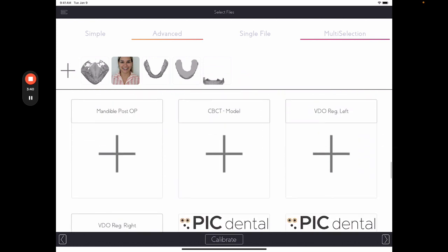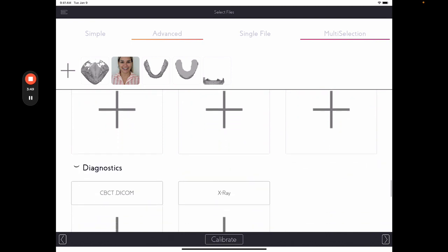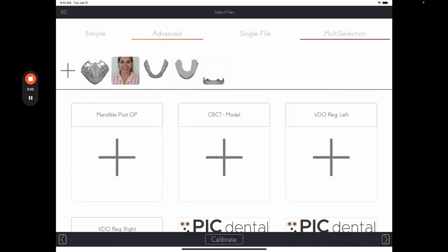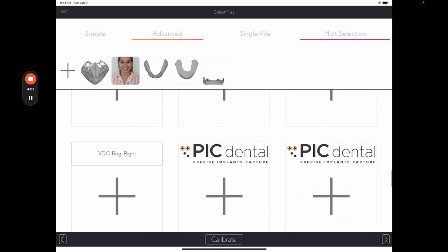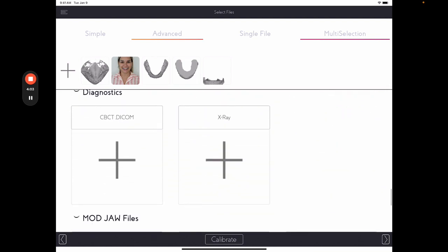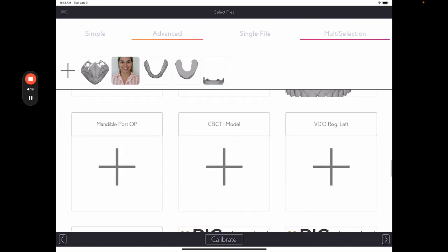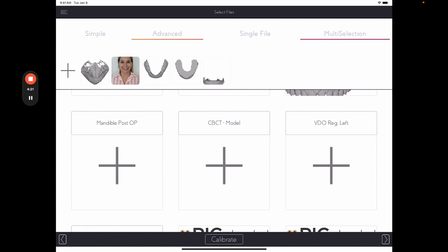I will also add the patient's CBCT model as an STL file. Notice that we have two boxes here. One here that says CBCT model, which is where you will add the STL file of your CT scan for you to see the bone part of your planning. And here at the bottom, we have the CBCT DICOM file.